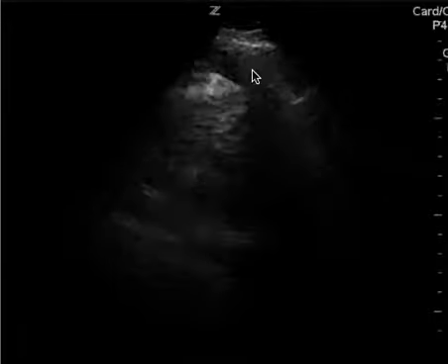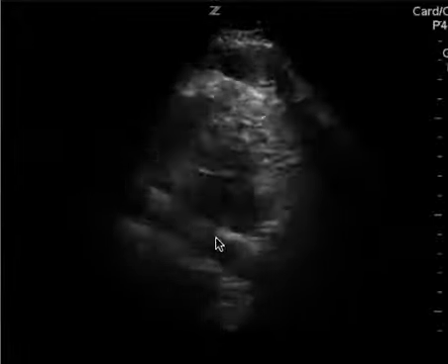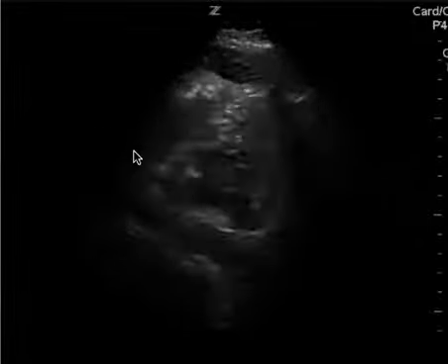This is the LV, RV here, and then you see this heterogeneous, mostly anechoic finding here. This is either a very large fat pad or a pericardial effusion. Hard to tell if this is a pericardial effusion or not, because I think this is the descending aorta here, and I can't tell if this is the atrium of the heart, whether left or right, or this is a continuation of the echogenic material.